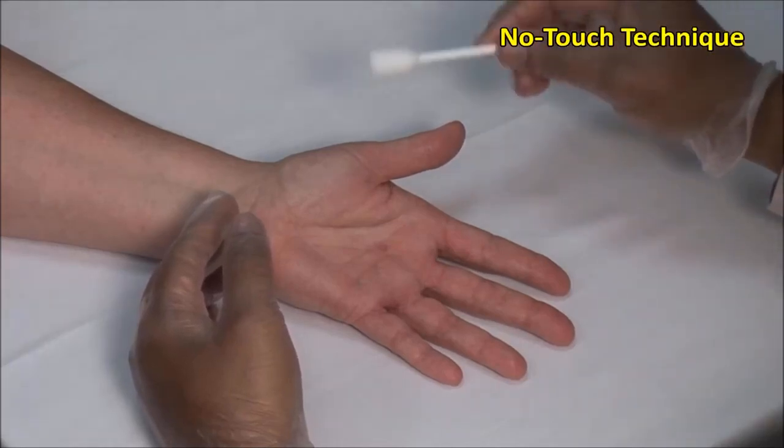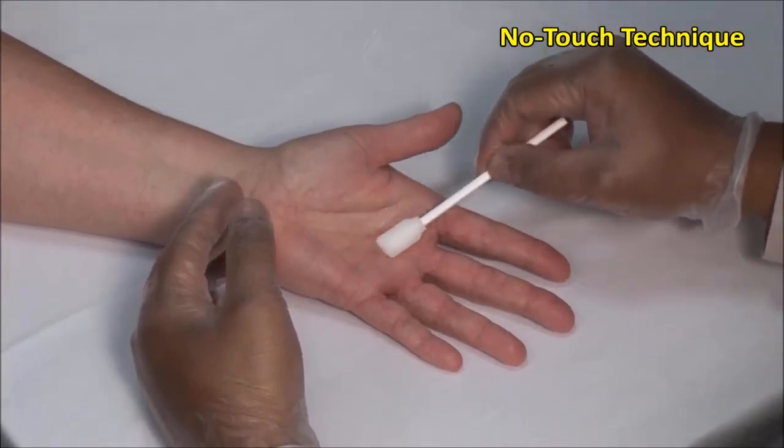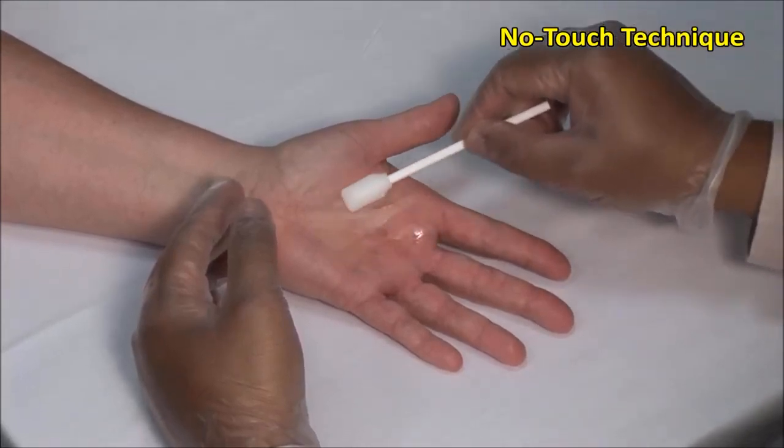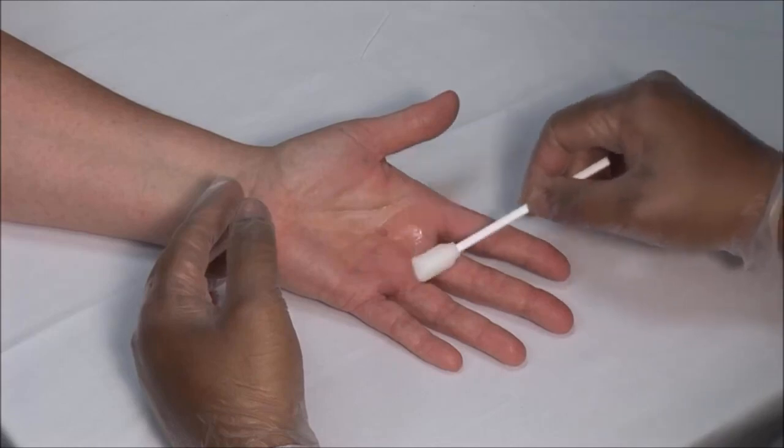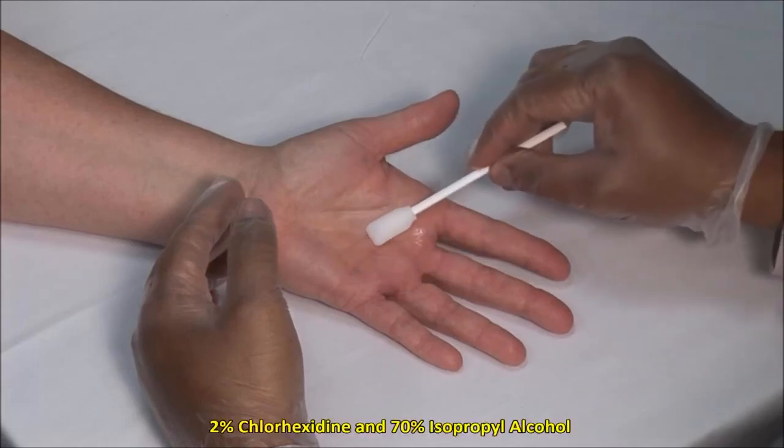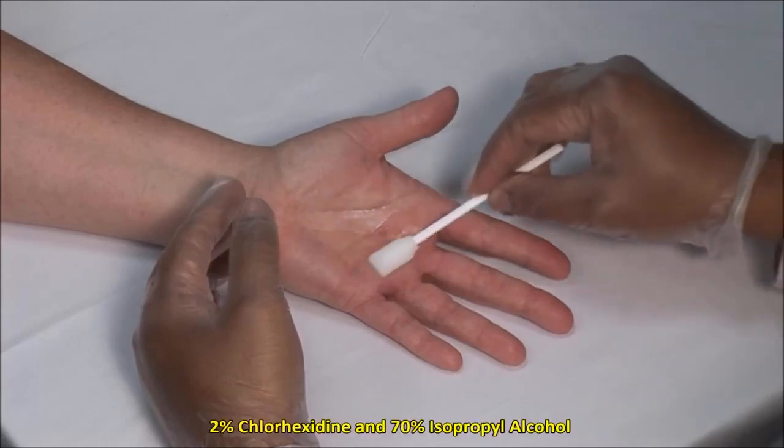A no-touch technique is used, meaning that once the area is clean it must not be touched with anything but sterile needles. I'm using a mixture of 2% chlorhexidine and 70% isopropyl alcohol.